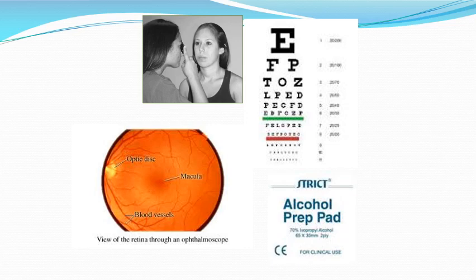If the patient wears glasses, he or she should be tested with the glasses on. Again, the patient would start with the smallest line and move upward until they can correctly read more than half the letters. If the patient is unable to read the top line at 20 feet, they could be placed a little closer to the chart, and then the test could be repeated.